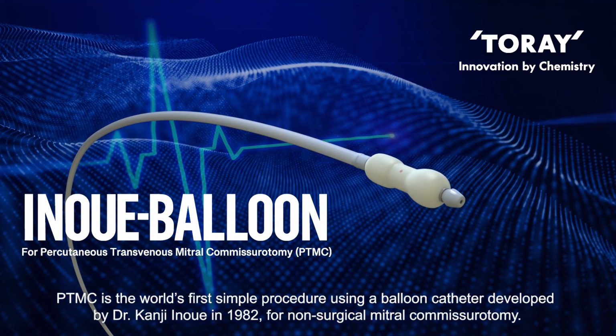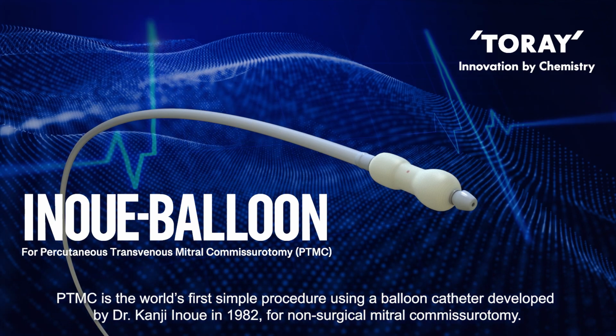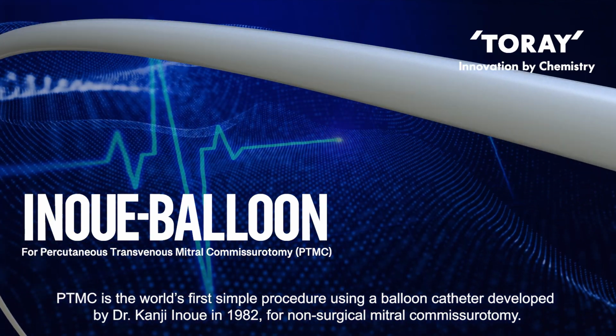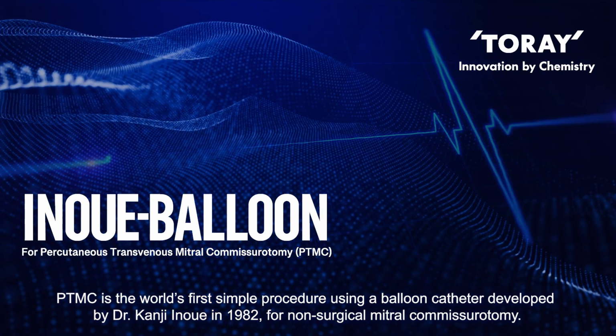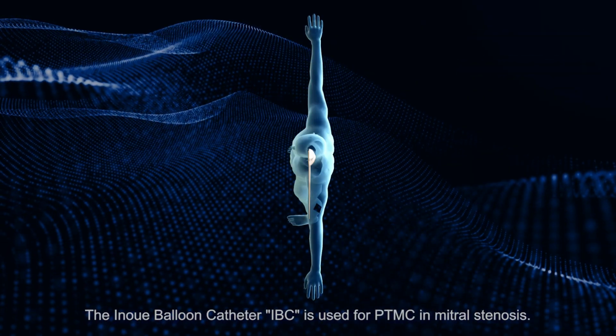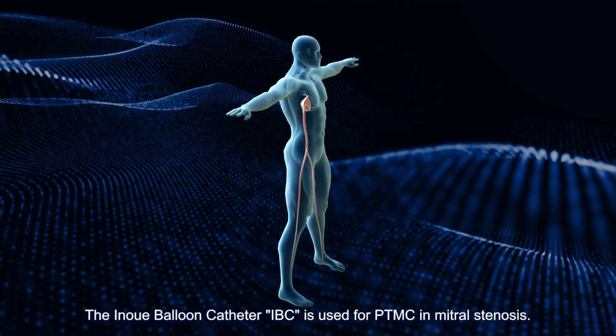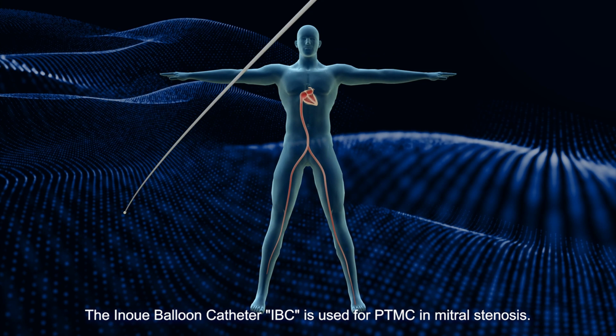PTMC is the world's first simple procedure using a balloon catheter, developed by Dr. Kanji Inoue in 1982 for non-surgical mitral commissurotomy. The Inoue Balloon Catheter, IBC, is used for PTMC in mitral stenosis.